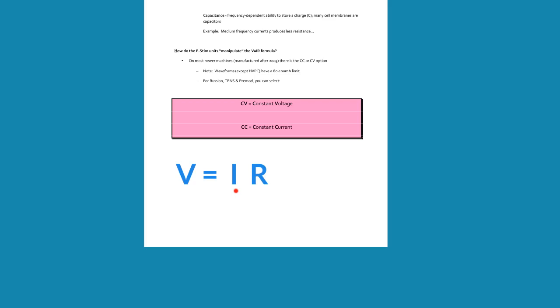And how do we typically measure current or intensity on electrical stimulation? How do we adjust that? Which unit? And how is resistance typically measured? And do we adjust that for our patients? So yes, we know that with intensity, we can turn that up, and that's typically measured in milliamperage.